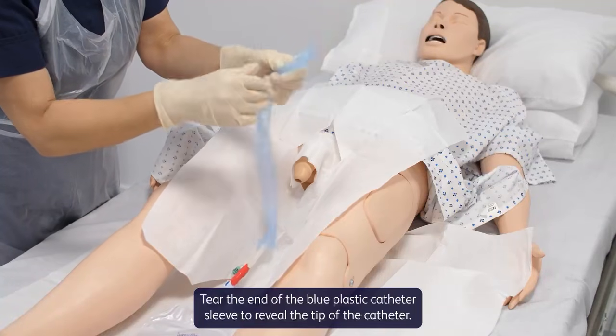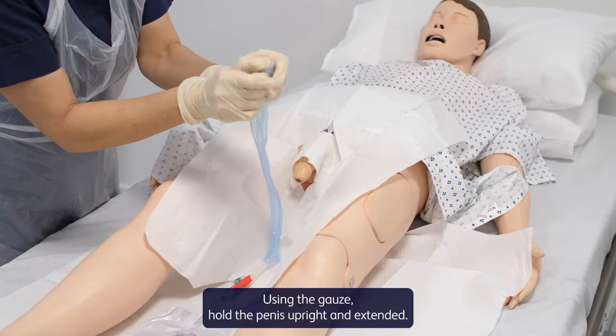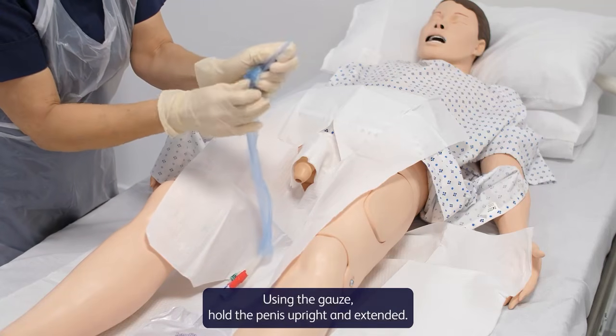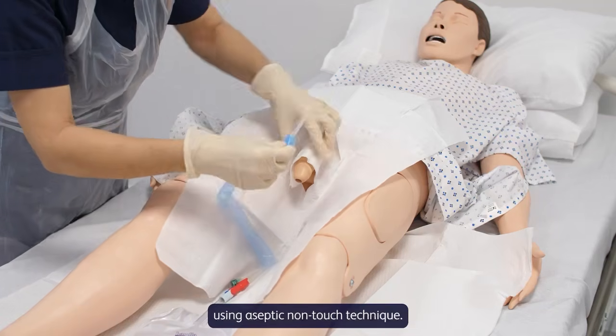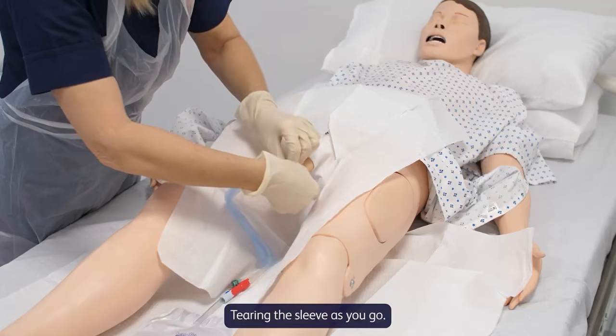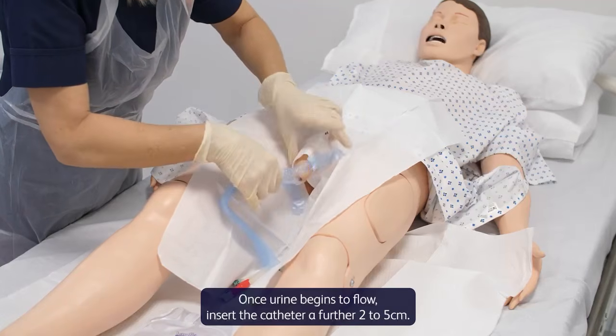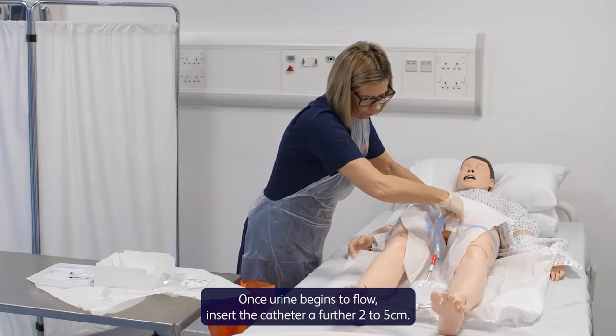Tear the end of the blue plastic catheter sleeve to reveal the tip of the catheter. Using the gauze, hold the penis upright and extended. You may now start inserting the catheter, using aseptic non-touch technique, tearing the sleeve as you go. Once urine begins to flow, insert the catheter a further 2 to 5 centimeters.